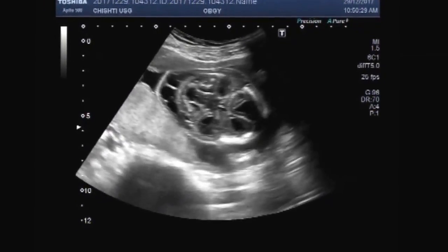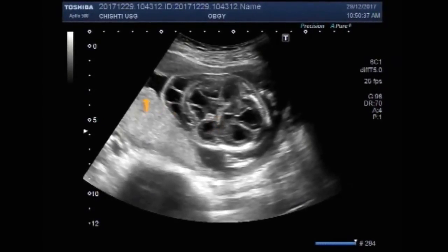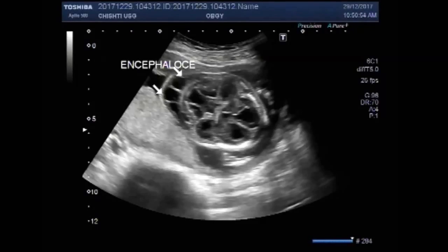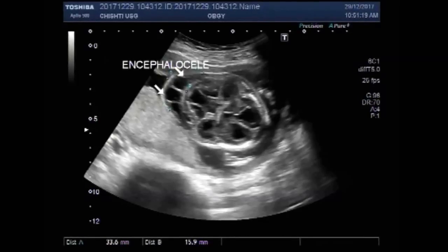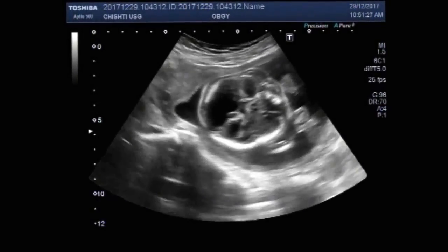Now you can see an encephalocele attached to the fetal head. Now this placenta is posteriorly attached.